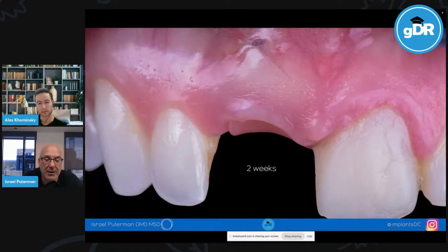And over the years, I've actually gotten more anal about that myself, is that they'll make the flipper, but I will place the flipper, because a lot of restorative doctors, even the good ones, frankly, good or bad, it really doesn't make a difference. I've seen it from everybody, is that sometimes it's really challenging to tell if the flipper is hitting that palatal area of a healing abutment, whether it be a standard healing abutment or a customized healing abutment. Yeah. So I like to do a double check myself.